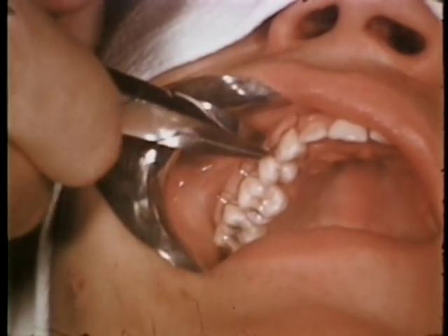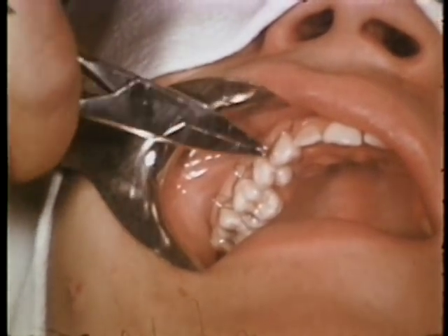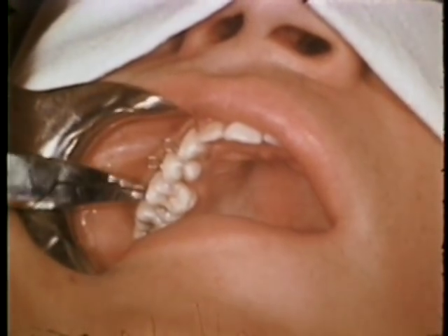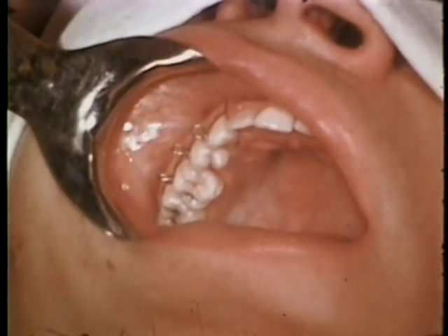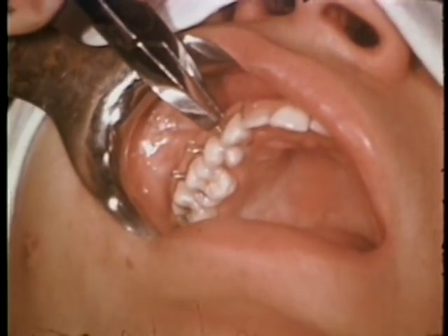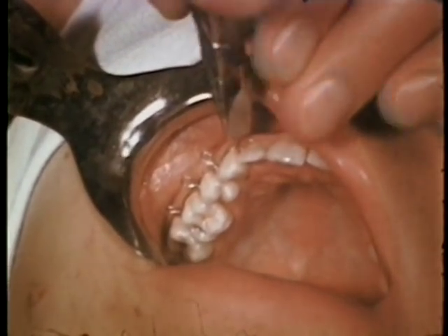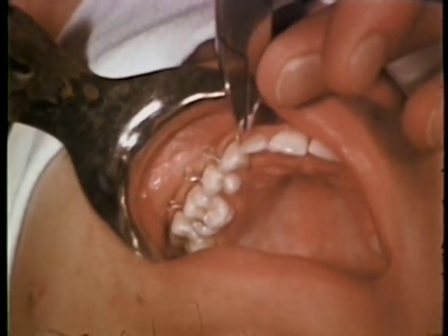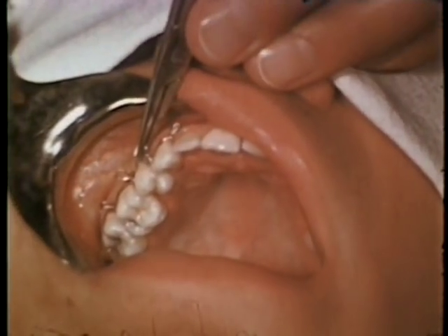Each loop is given a three-quarter turn in a clockwise direction with flat-nosed pliers. An additional one-half turn is given each loop, making a total of one and one-quarter turns. This precise number of turns is important when using brass wire to prevent breakage. Stainless steel wire will tolerate more stress, but usually one and a quarter turns will suffice, irrespective of the wire used. Final tightening of the ends is accomplished after all loops are formed and twisted.